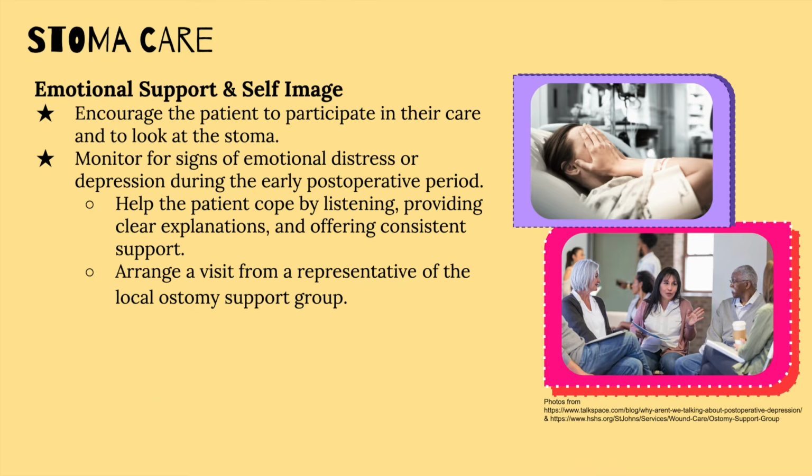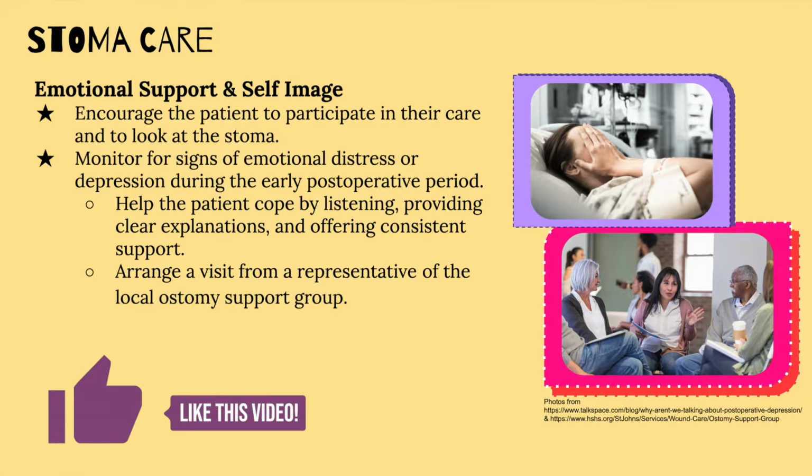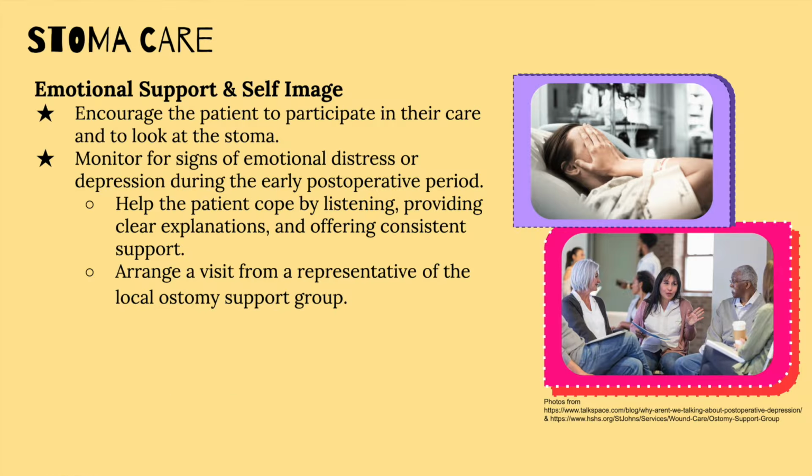Encourage the patient to participate in care and to look at the stoma. According to the Wound, Ostomy, and Continence Nursing Society, patients usually begin to accept their altered body image when they are willing to look at the stoma and make neutral or positive statements concerning the ostomy. Also, it's normal for patients to experience a period of depression during the early post-operative period. Help the patient to cope by listening to them, explaining details, and being available and supportive. A visit from a representative of the local ostomy support group may also be helpful.